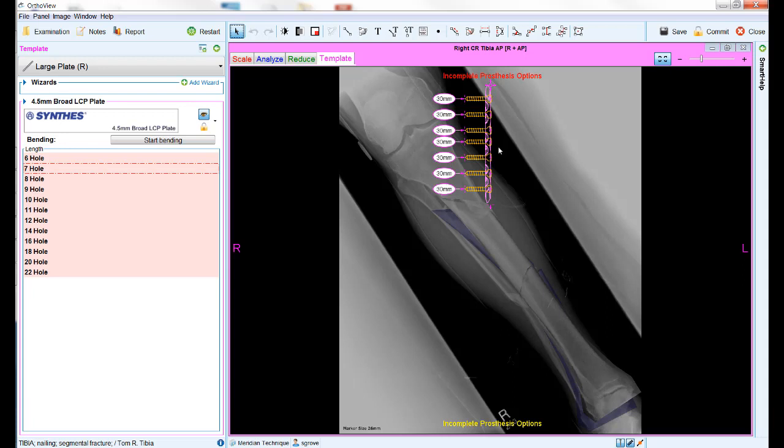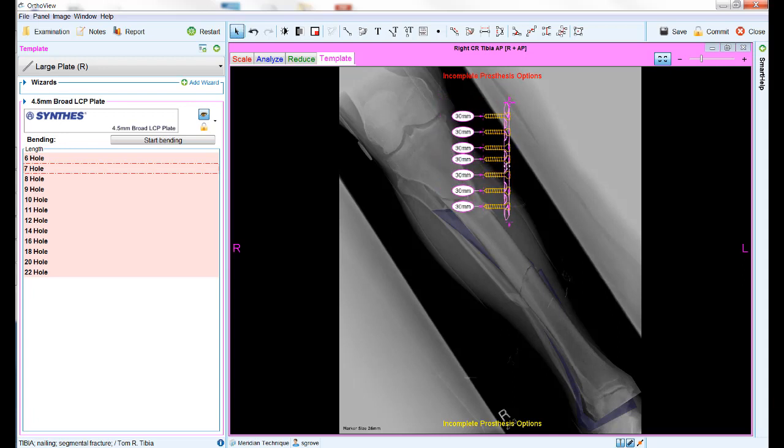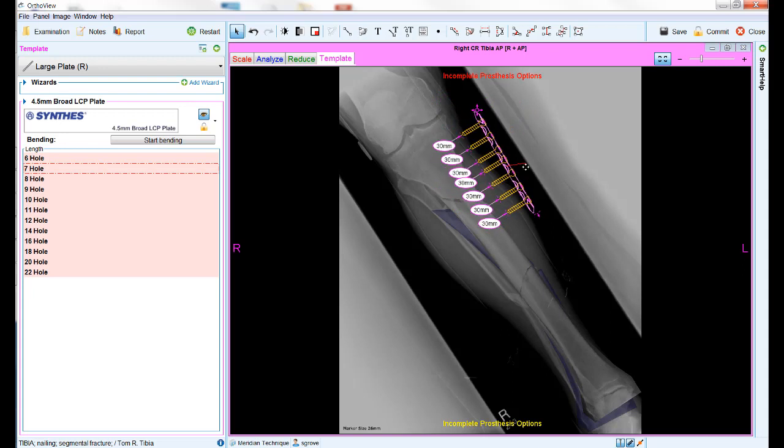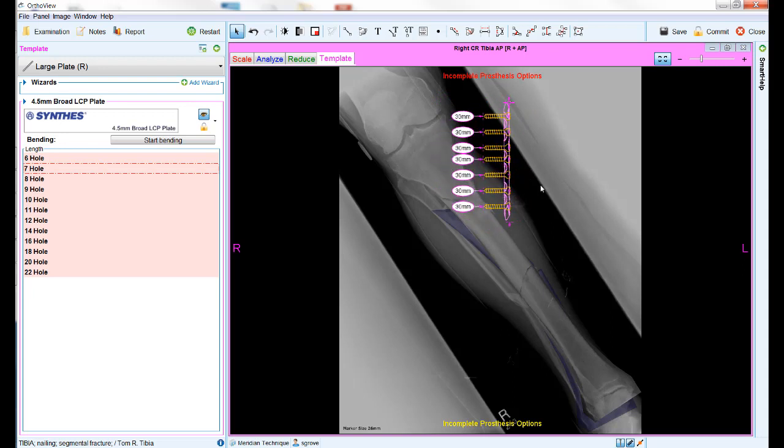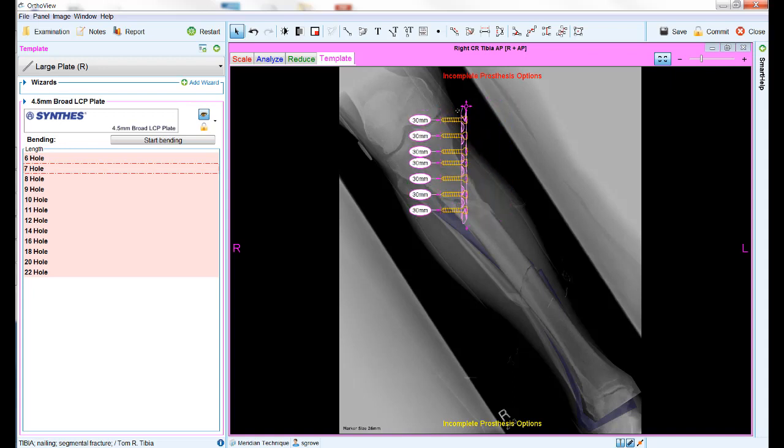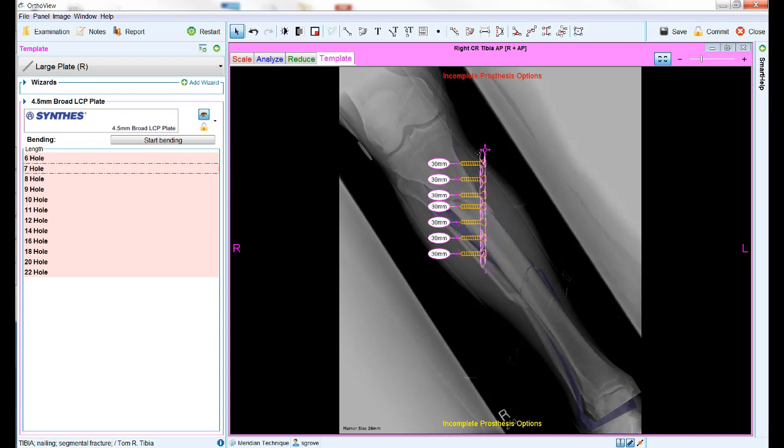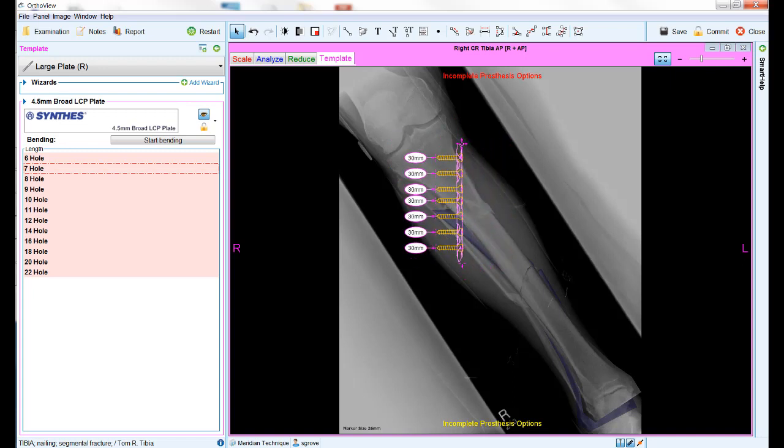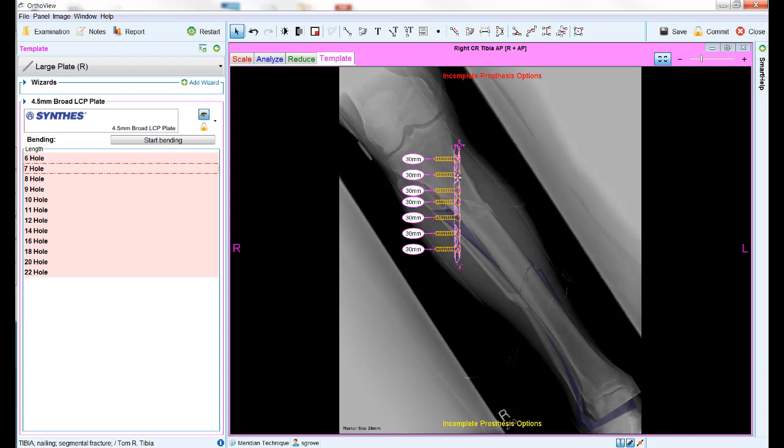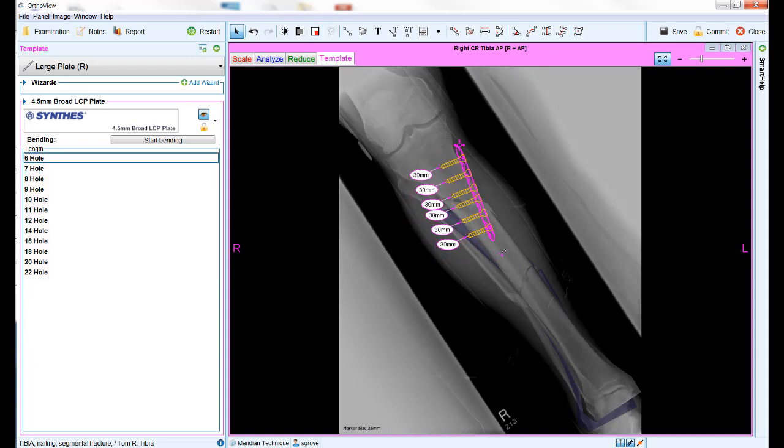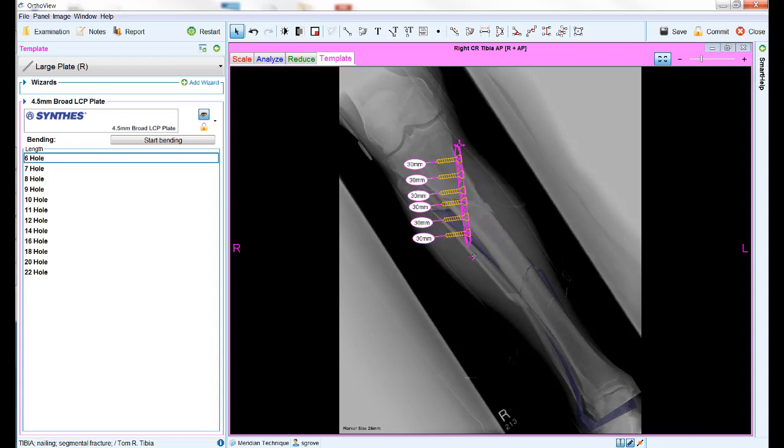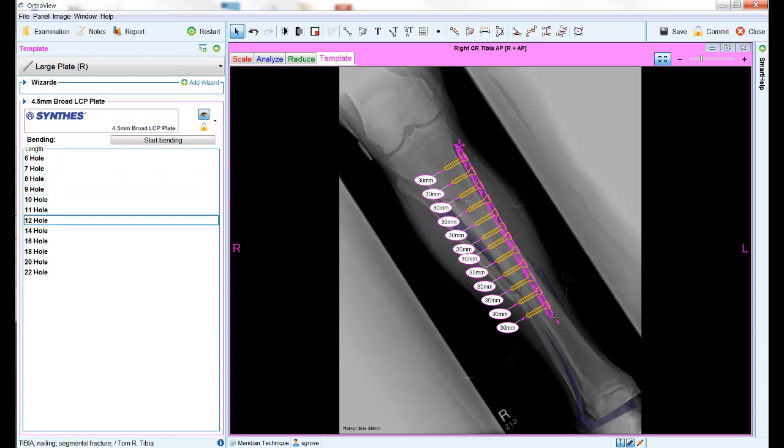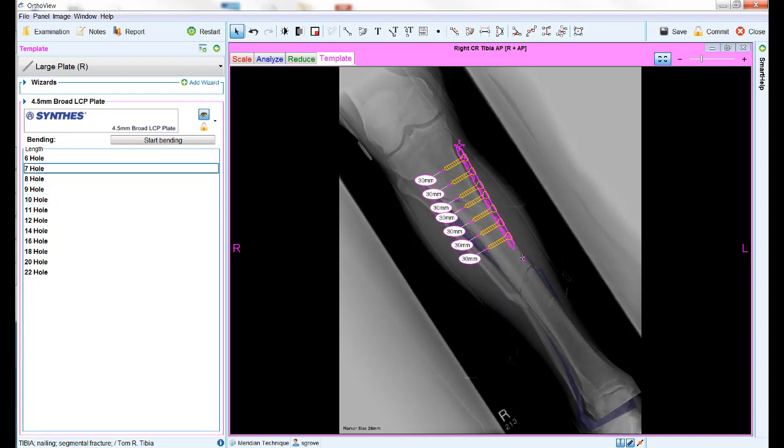In addition to the usual options of left click to move and right click to rotate, there are some unique positioning options for fracture plates and nails. As with all templates, there is a main control point usually at or near the top of the template. This point can be used to move it around by left clicking and holding down the mouse button and dragging. There is also a secondary control point at or near the bottom of the template that can be used to pivot the template around the main control point and also dynamically drag it through its range of lengths or sizes as appropriate. These two control points make it easy and intuitive to position and size the template on the anatomy. Additional options such as nail diameter are selected in the menu on the left.